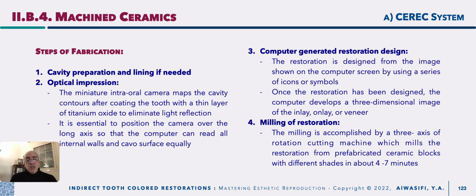okay, you are using either 2D or 3D cameras that need you to spray the cavity preparation with anti-reflection powder, which is titanium oxide, to eliminate the possibility of light reflection spots, okay, that will be produced and need much more correction when you are designing your inlay or your restoration. But for the newly developed OmniCam cameras, you are not in need of this step. Only care should be taken, because the technique sensitivity is limited to the optical impression procedure.